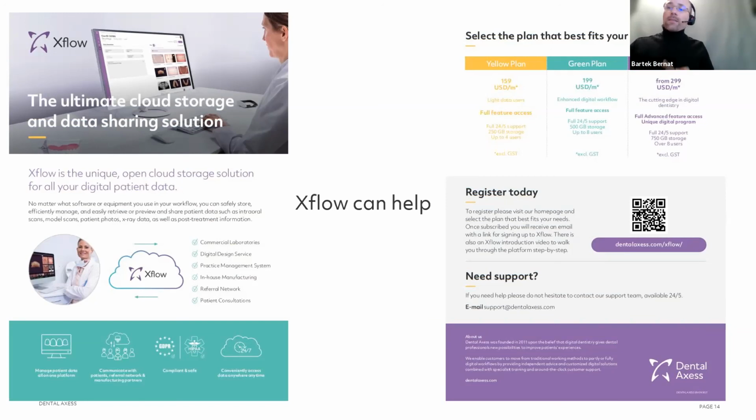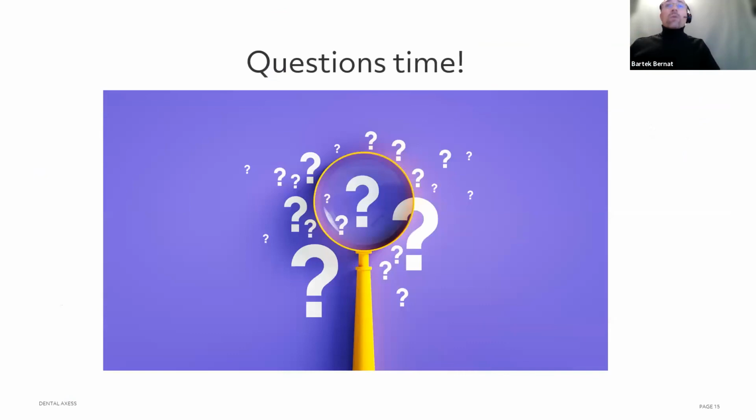And that brings me to the question time. Okay, so let me just see now questions and answers. Okay, let's have a question. How do you get the record that you would normally capture with muscle trimming?